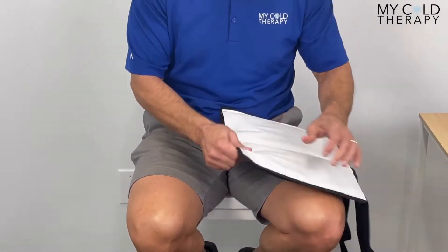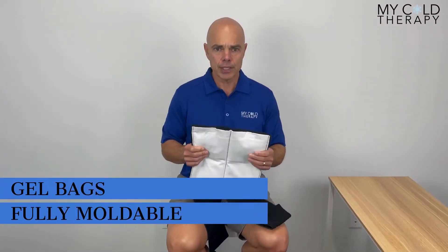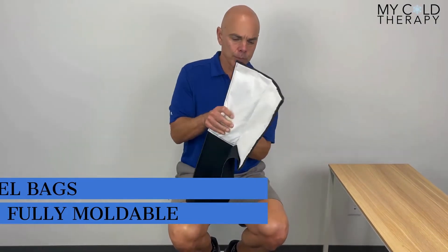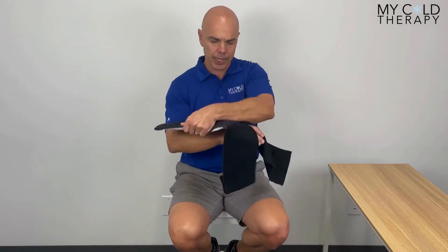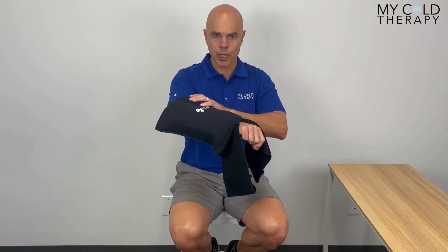These just came out of the freezer, so the first thing we want to do is kind of break these up. This is a moldable cold therapy wrap, so as you can hear, you want to make it nice and moldable. That's one way to do it by hand. You can also take it on your arm and mold it around your arm as well.